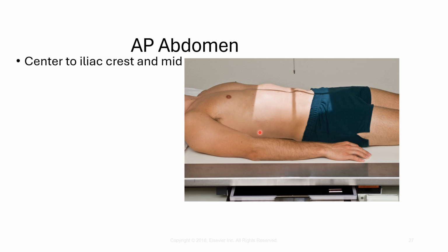like this. This would be a good example of your T-shot. So you get an image lower to capture the pubic symphysis with a portrait IR, and then you would do another image receptor after this picture placed landscape to capture the diaphragm. Okay? So on this particular one, they're telling you iliac crest and midline, no diaphragm needed.